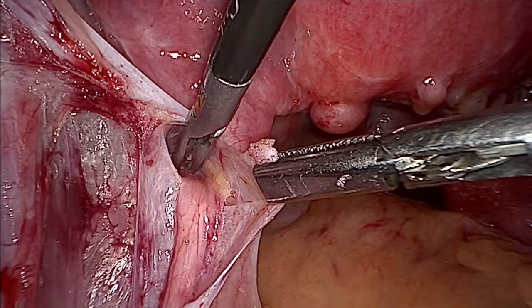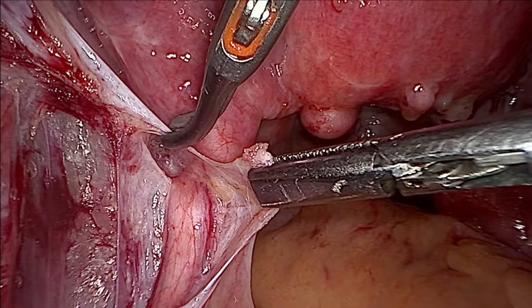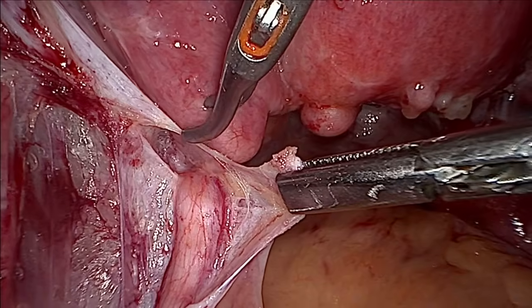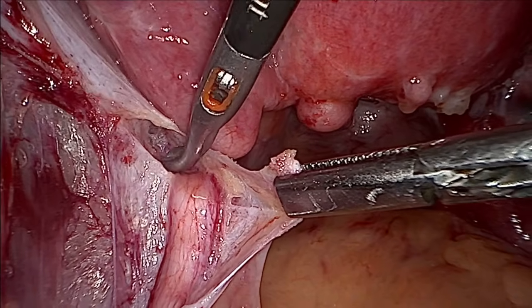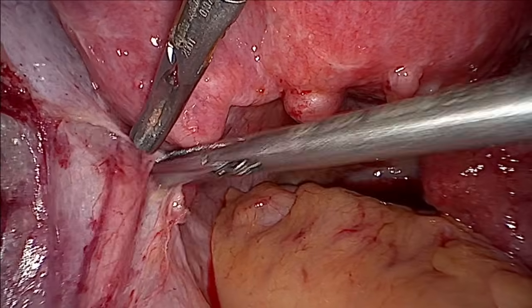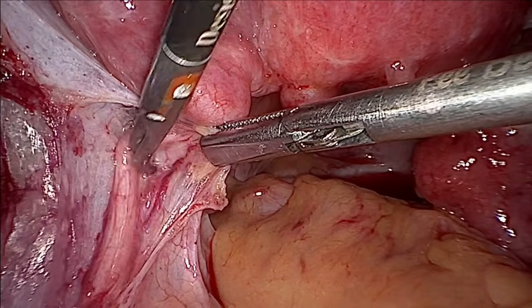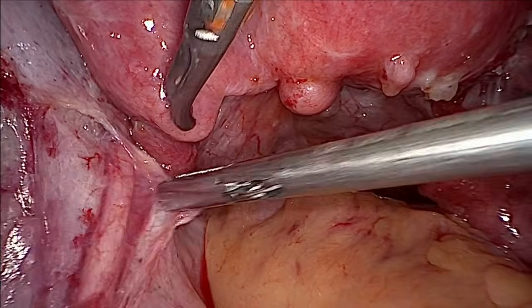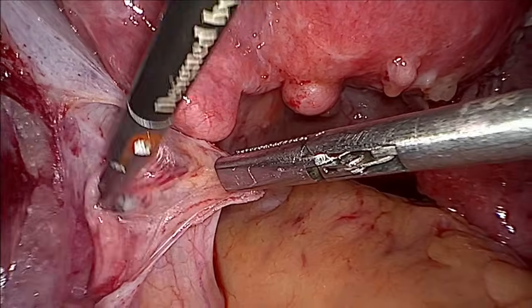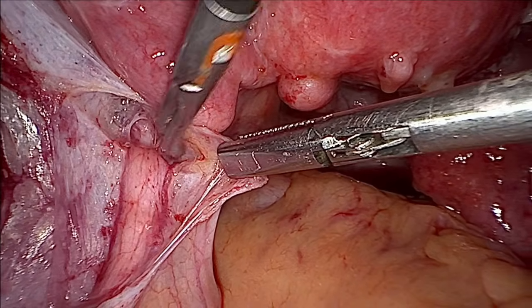You go to the ureter, you open up your instrument and there you will get a plane, and you cut. Again go, create a plane, advance your instrument and cut. There will be some fibers of the ureter, you can see these vessels surrounding the ureter. This is the adventitia of the ureter.